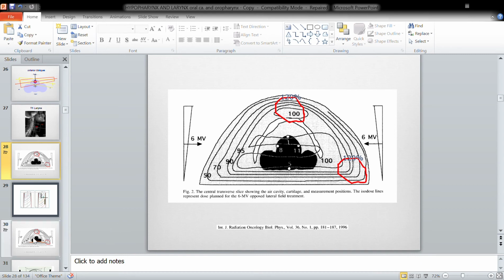Why would I make the plan worse? So I use what we call under-wedging. This is not hadadiyat, by the way. This is physics, and I'm sure a lot of people are doing it. You may have read it in the book, but you may not understand what it means. So I usually take the opportunity to describe it, because we use it quite a lot back home actually.